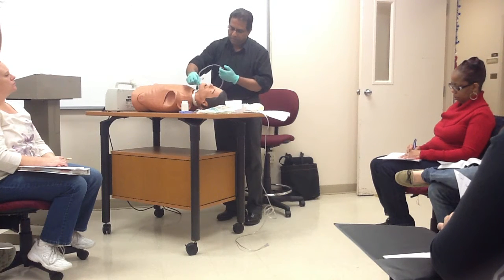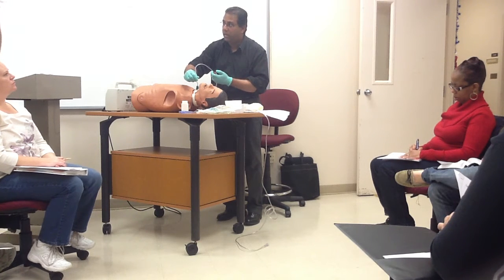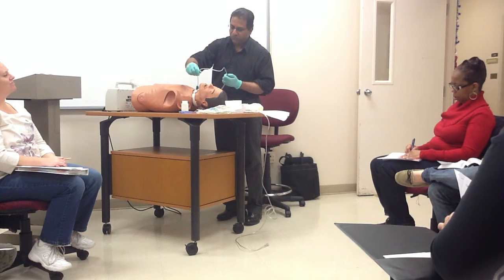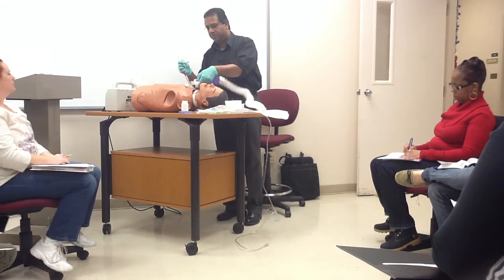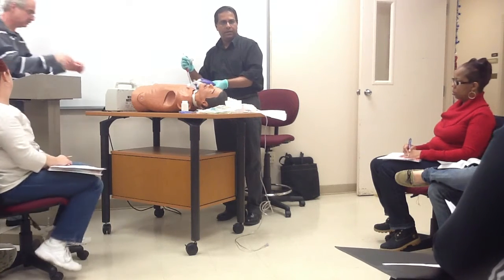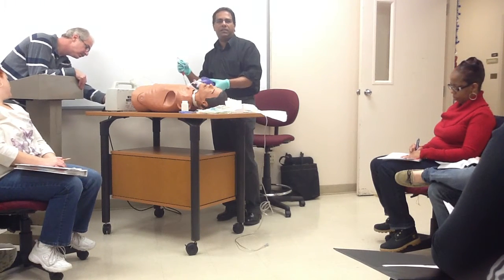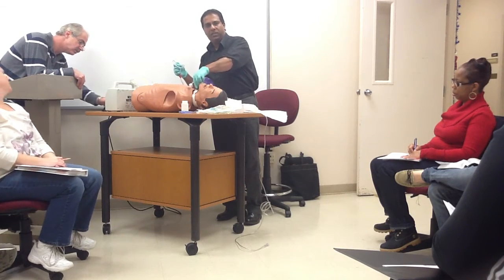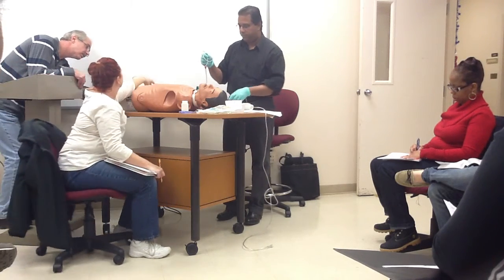All right, the catheter in. Once I meet the resistance, I do not go down again. Suctioning, suctioning intermittently. And hyperoxygenate. Can you turn that on? Isn't there a certain distance you want to go, not just meeting resistance? Well, especially with the neonates and pediatrics, they give you a certain length. With adults, what we tell them is meet the resistance.